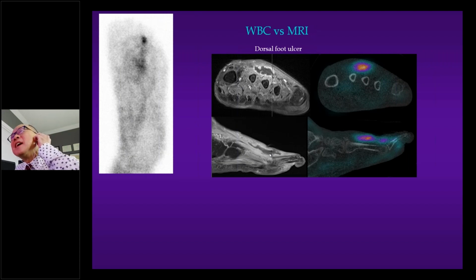And so we reported this, and the report was complete and nearly signed off. In fact, I think it was signed off. And I was trying to impress my musculoskeletal fellow that in the nuclear medicine department, we have the means to demonstrate the same pathology. I noticed that a white cell scan preceded this MRI by a day or two. So I brought my MSK fellow with me to our nuclear medicine department, introduced him to our department, and asked my colleague on duty at the time, Dr. Ling, to pull out the case and show him. And so here it is, easy concordance, beautiful concordance.